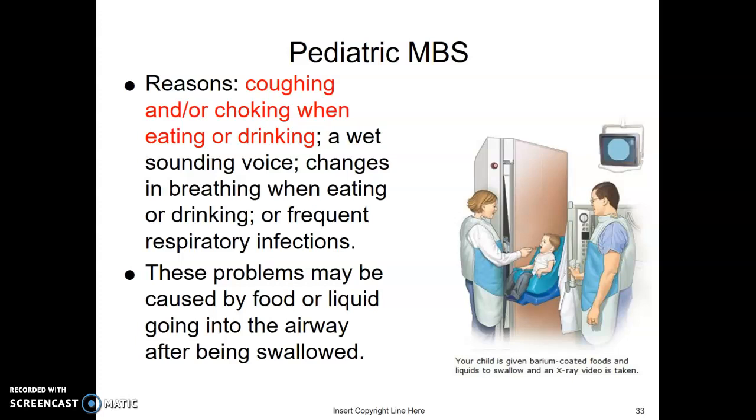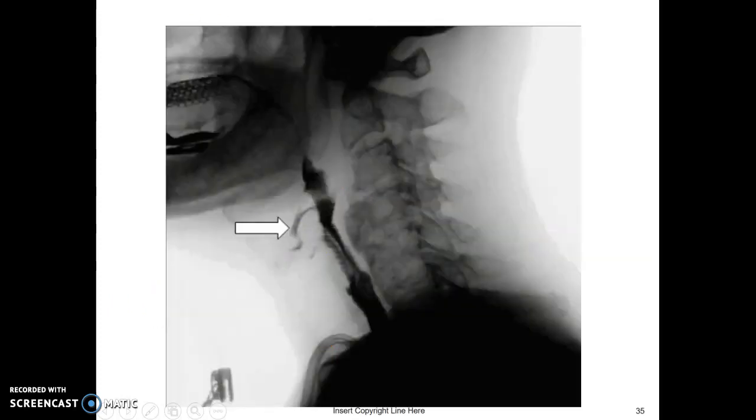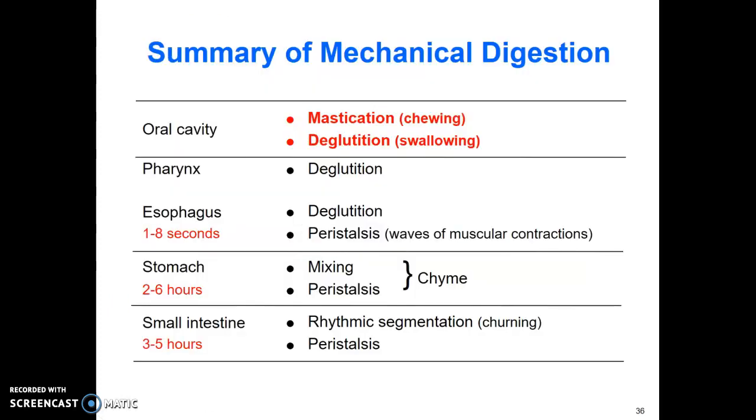For infants, it's just thin barium through a bottle. As they get a little bigger, they get a few other things, but infant studies are really quick. Aspiration is when food or liquid enters the airway — the trachea is anterior to the esophagus — and you can see the contrast coming down into the airway on the image. That's what we don't want.